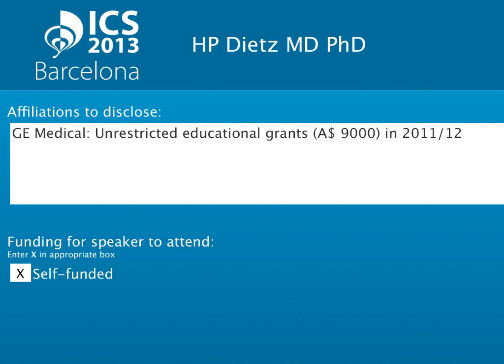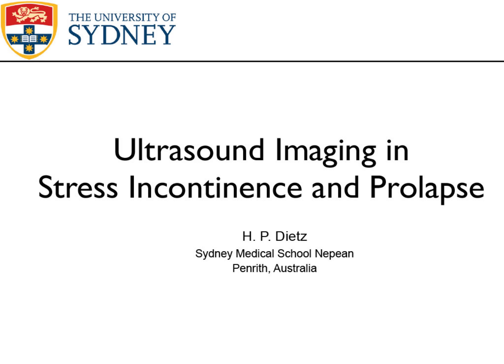Okay, that's the disclosures. I'm going to complement what Matthias Oelke just said with an overview of what you can get out of using ultrasound imaging in stress incontinence and prolapse. And I'll say from the start that really in stress incontinence it is primarily post-op use and use in people who have got problems after surgery. In prolapse, it's a whole lot more.